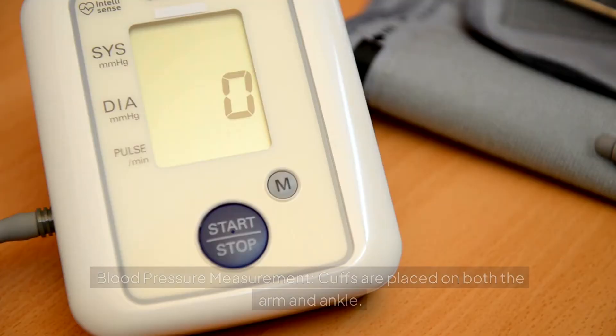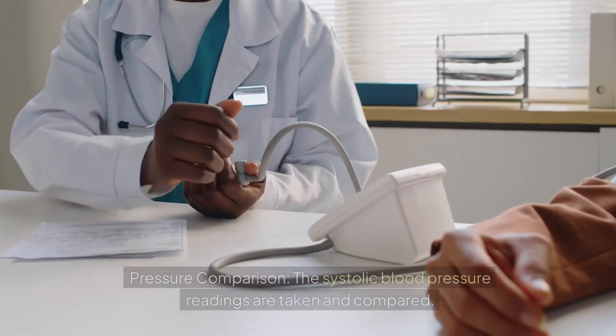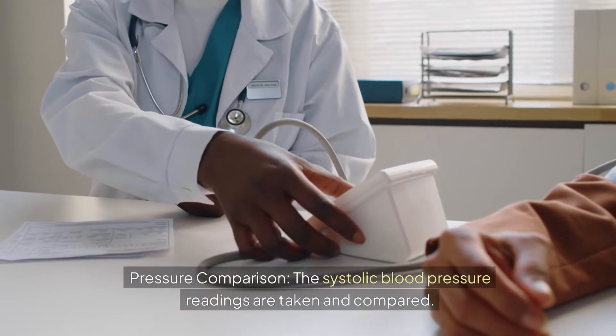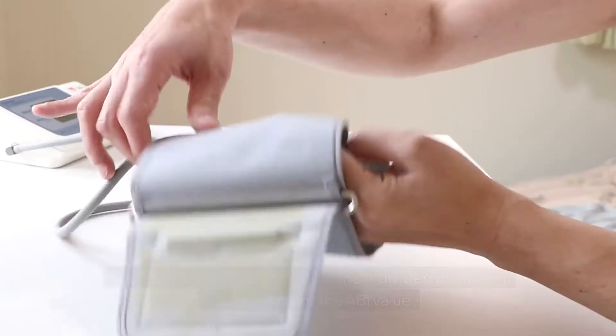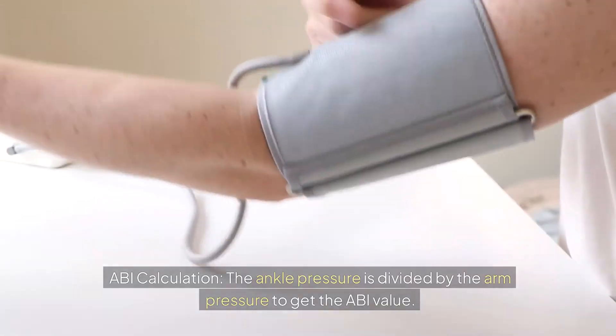How it works. Blood pressure measurement: cuffs are placed on both the arm and ankle. Pressure comparison: the systolic blood pressure readings are taken and compared. ABI calculation: the ankle pressure is divided by the arm pressure to get the ABI value.